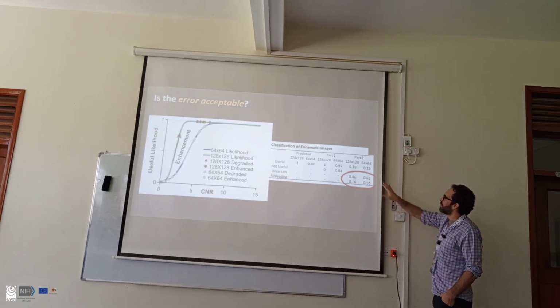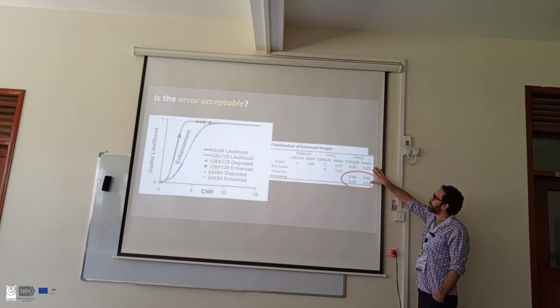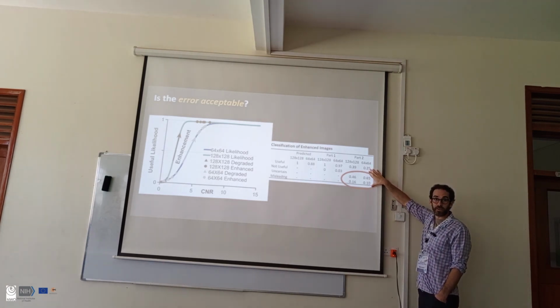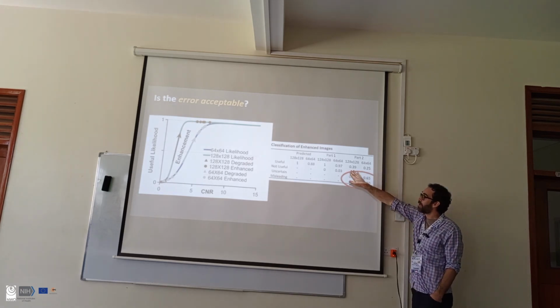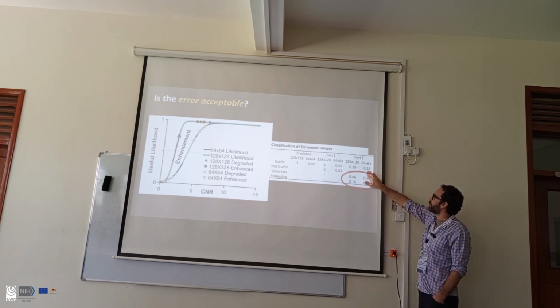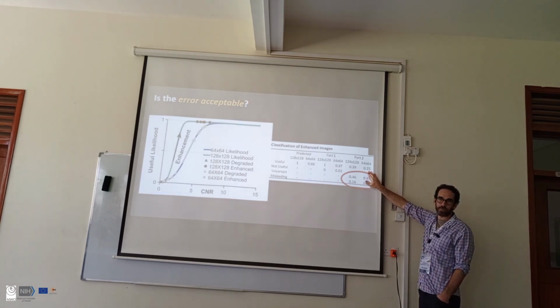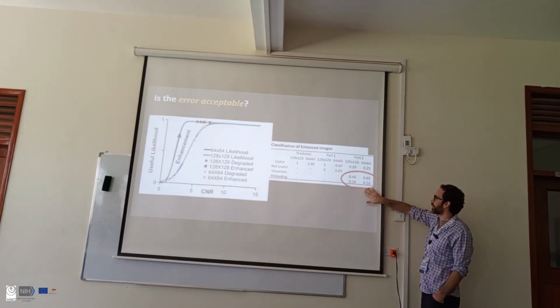More or less? So when we get to part 2, this is where it gets interesting. Because in part 2, they're asking if the errors are acceptable when comparing with ground truth, right? And now, with the revised scores of these enhanced images, only 25% of the 64 by 64 images remained useful, 39% of 128 by 128.